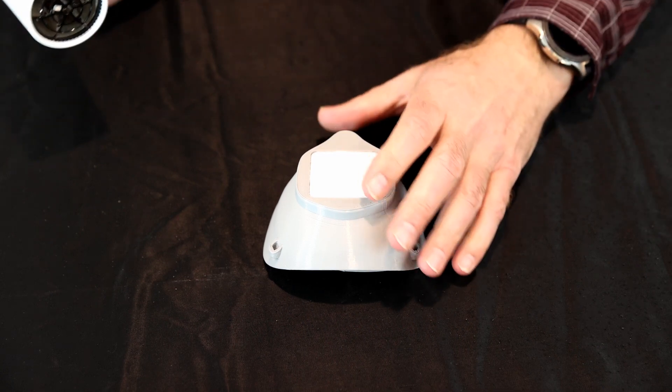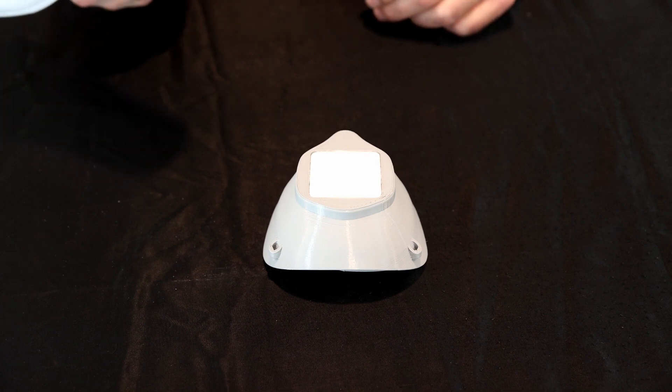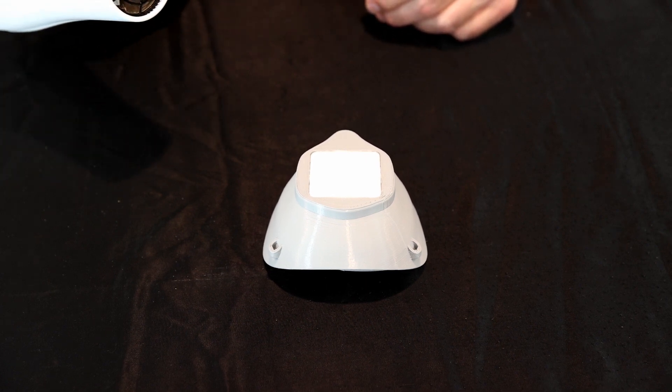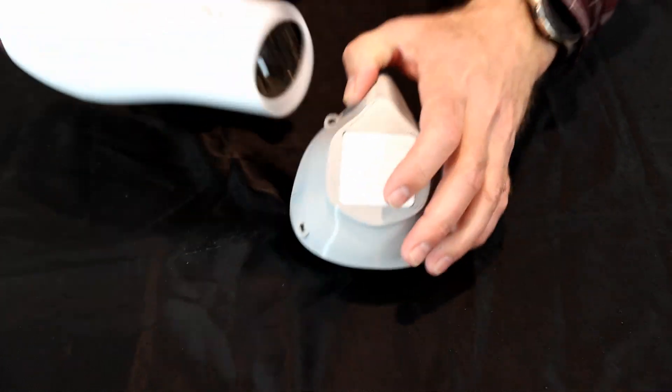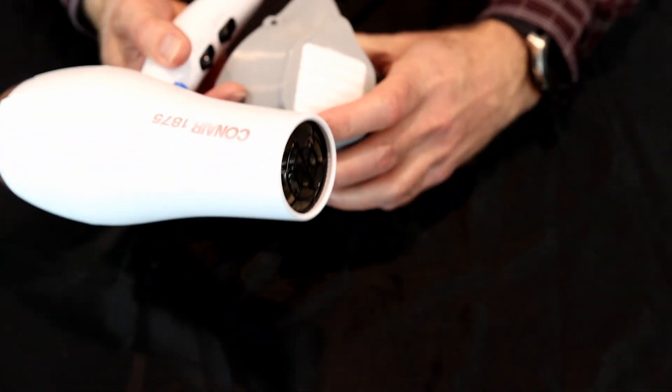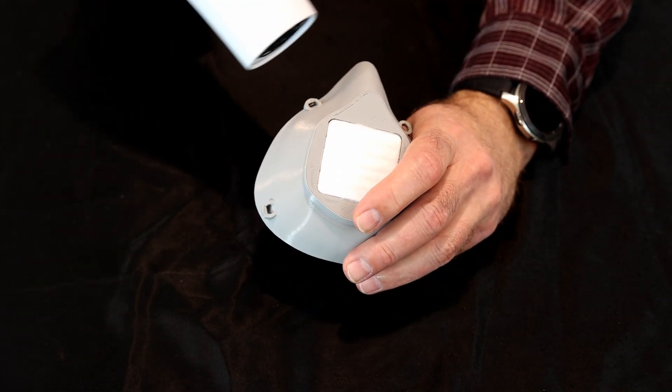Once the seal's in place, you can form this. You can do this by using a hairdryer or dip it in some hot water. So what I normally do is take the hairdryer and just warm it up.